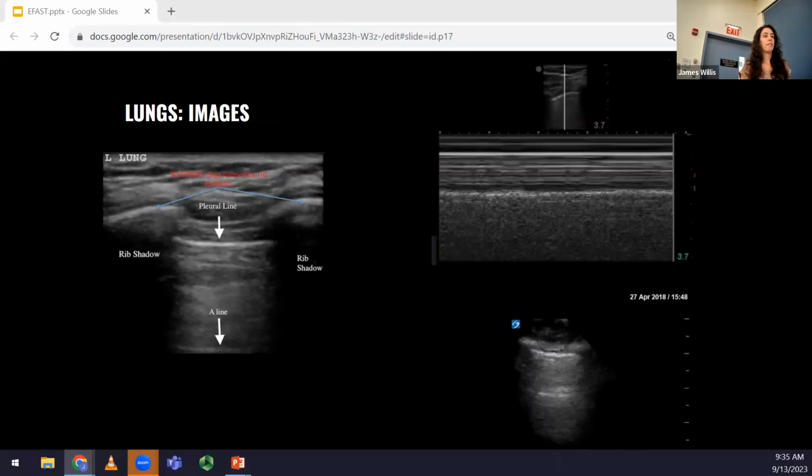When you are in a very busy trauma and the trauma surgeon is across the end of the bed and already doesn't trust the probe in our hands, and you're trying to figure out if there is actually a pneumothorax, it can be really hard for everyone in the room to trust that they're seeing lung sliding. So what we often do is use M mode. So M mode in the ultrasound, you're taking this one physical point, and you're looking at it over time.